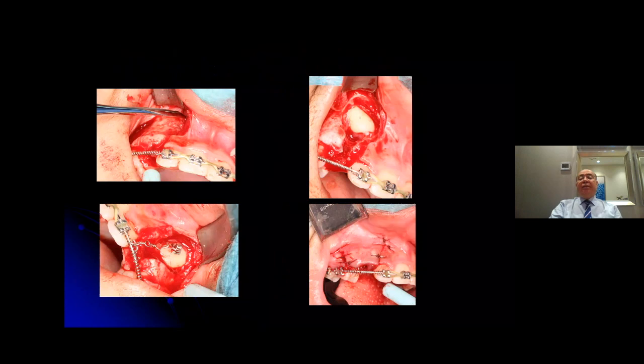Again, I removed the bone, and you can see in the top right photograph that I actually created a tunnel, and this was the plan between the orthodontist and myself. This tunnel technique is becoming extremely popular because it guides the canine into place and also helps the canine come down very quickly compared to the conventional way. And another way is not doing a tunnel.